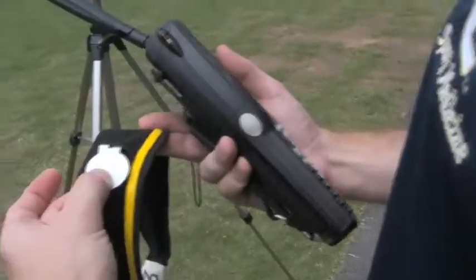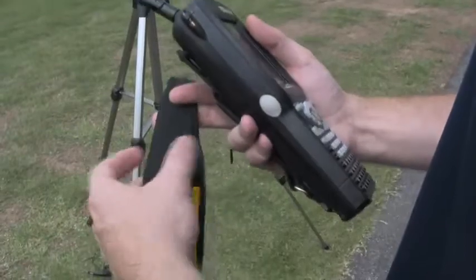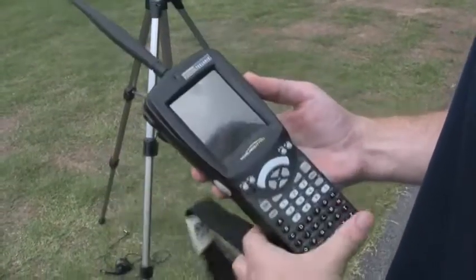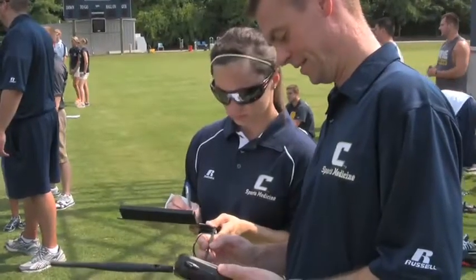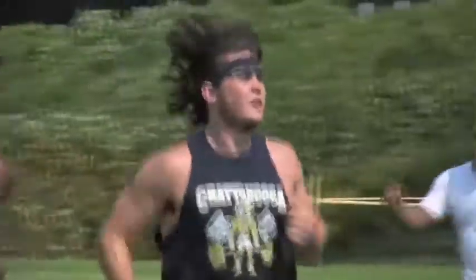A thermistor inside this white patch on the forehead transmits data via this transmitter to this device, where a computer program runs it through an algorithm that is supposedly displaying core temperature for each player that we're monitoring.